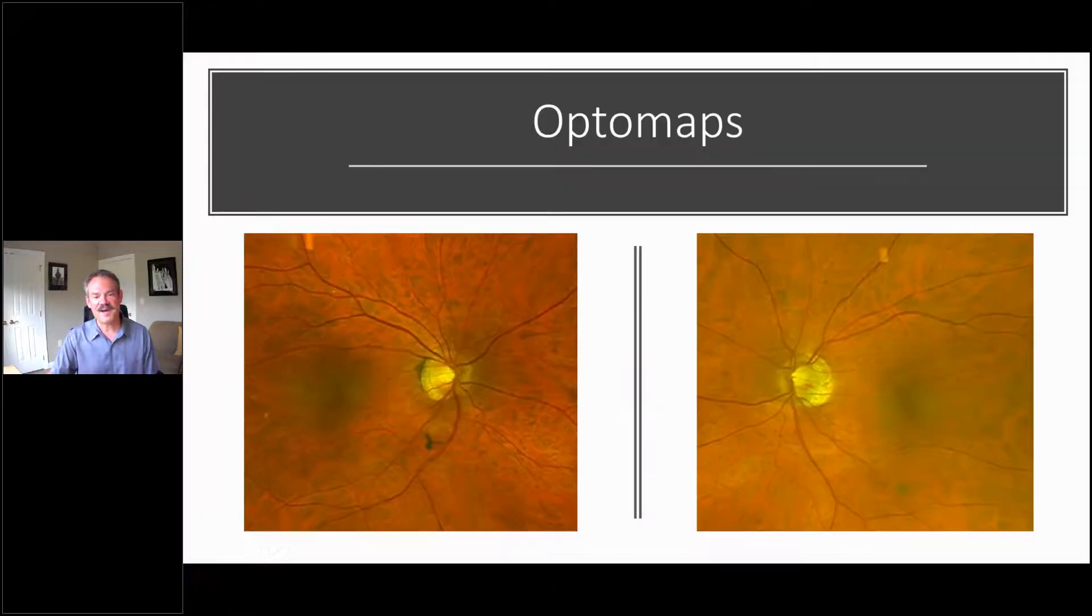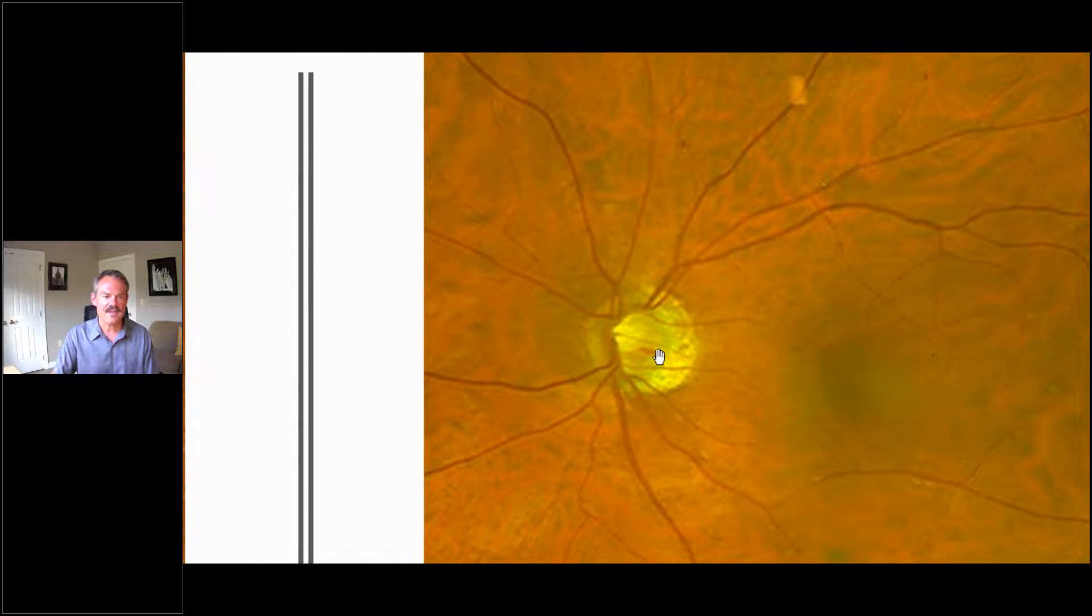One final piece of the puzzle here are the optic nerve photos from our Optomap. Here's the right eye, here's the left eye. If you look really closely here, we can tease out that here is a really small Drance hemorrhage.